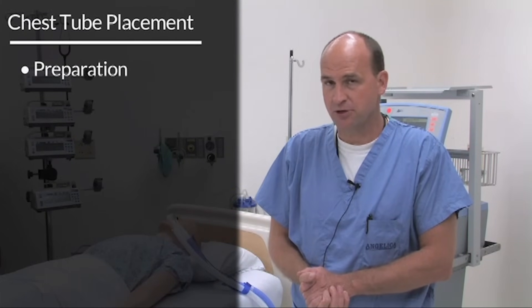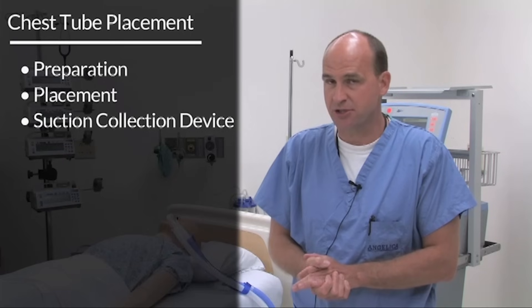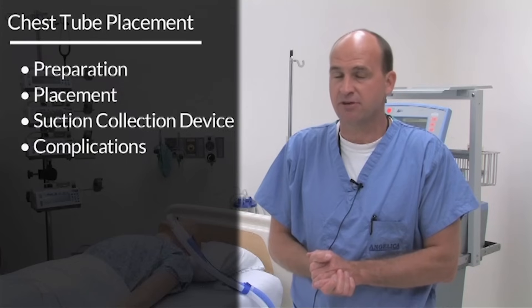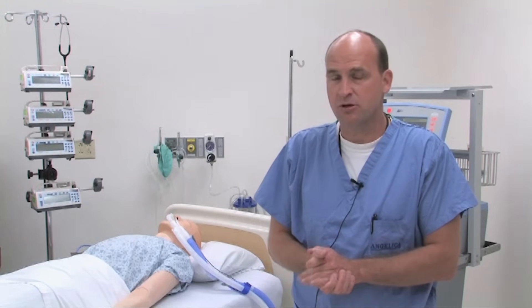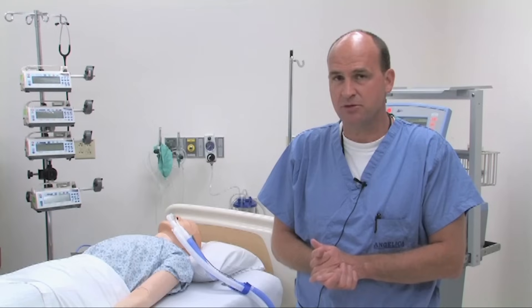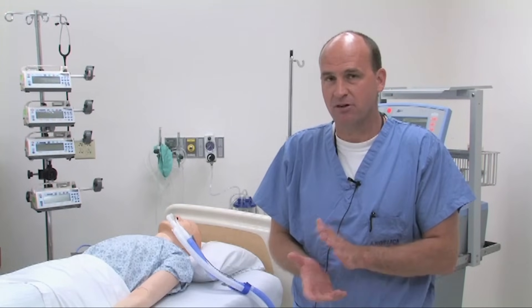During this demonstration, I will show you the steps to prepare the patient for a thoracostomy tube or chest tube, the steps involved with physically placing the chest tube, and then hooking it up to the pleurovac device or suction device to remove both air and fluid from the chest. We'll also go over possible complications with placement and with a malfunctioning or non-functioning tube. The use of sedatives or other agents is beyond the scope of this video, but patient safety and the relief of pain and discomfort are of paramount importance.